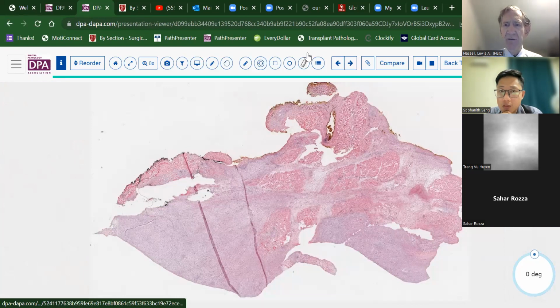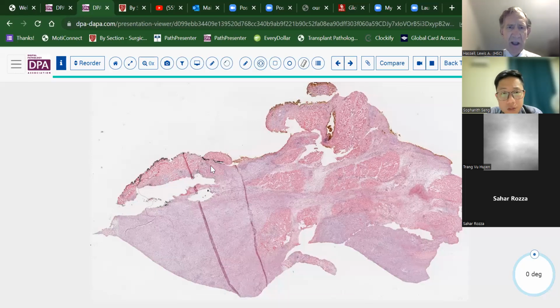in the evaluation of margins. So this sample, as you can see, is from a soft tissue. We have some skeletal muscle here, and then we have this sort of pale staining infiltrative pattern of tumor that we can see here. So here we're being asked to say, is the tumor at the margin? And therefore, do I need to do more surgery at this margin, or do something further? Consider that as a possible, what I might additionally be able to do.